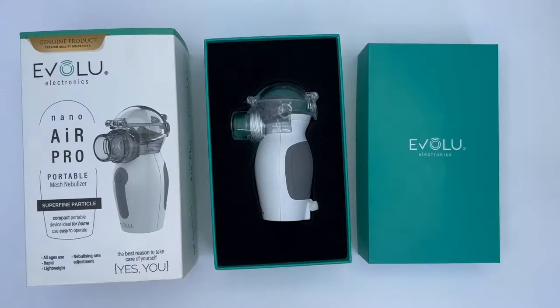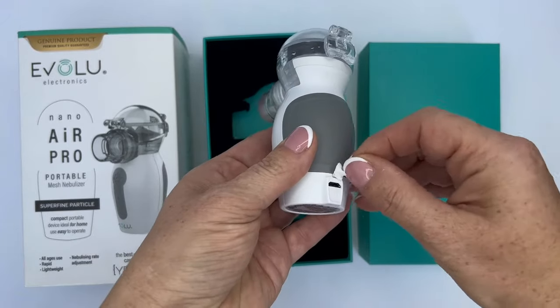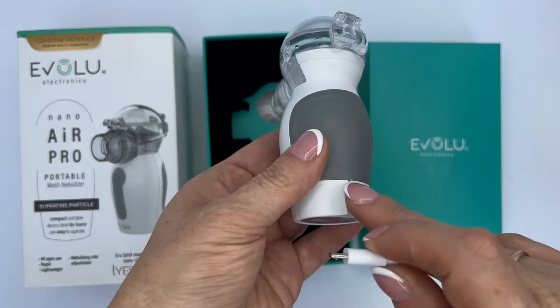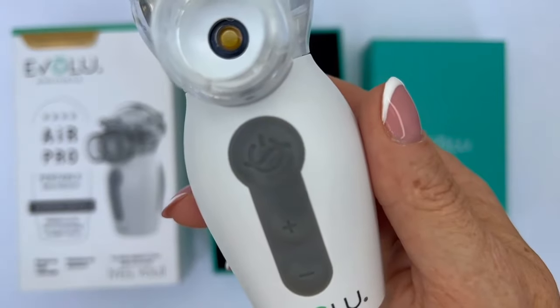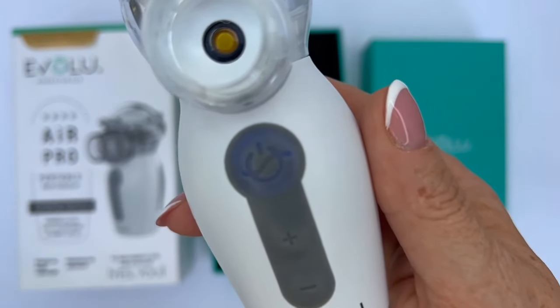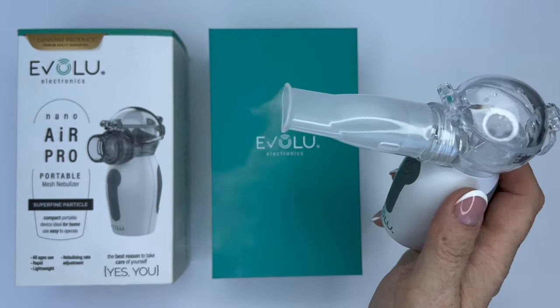The device needs to be charged in the same way as a mobile phone. It has a built-in battery and can be recharged via a USB cable. When the battery is low, as well as during the charging process, the blue light will flash. When using the inhaler for the first time, it should be charged for at least 30 minutes.